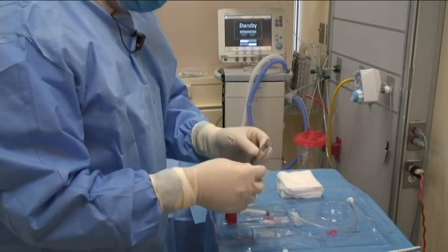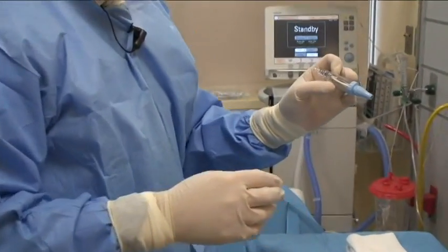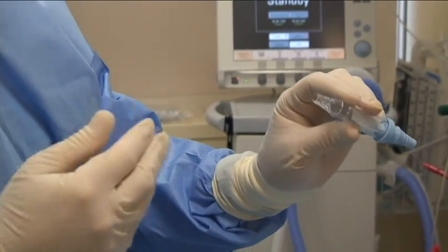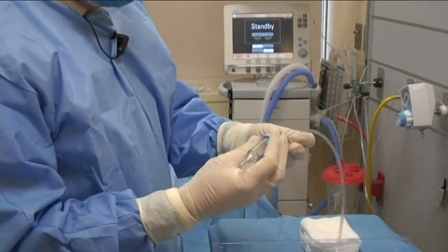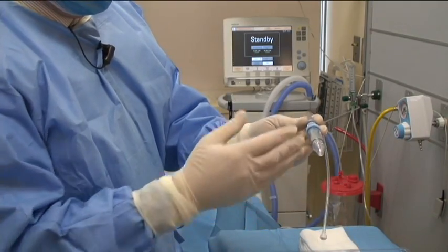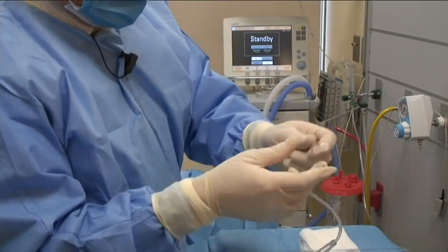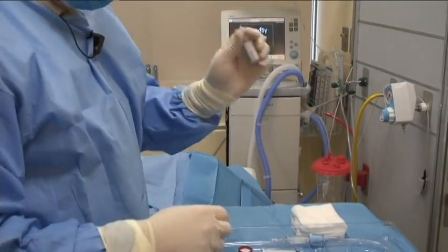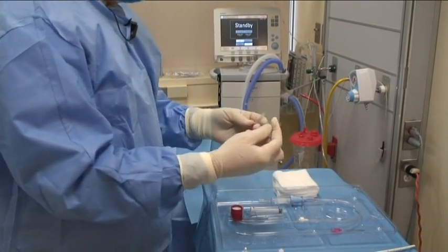It has some iodine. And the kit has actually, it's a very nice Heimlich valve. This is really good for pneumothoraxes. It's a one-way valve that allows air to escape out of the patient's chest, but nothing can go back into the patient. So you can connect this in the direction of the arrow to your patient, and you actually leave this open and the air would be able to come out, but no air can come back in. Again, this is a Heimlich valve, and this end of course can be attached to the end of the chest tube when you're ready. Some lidocaine for anesthesia, for numbing up the area, and two different needle sizes.